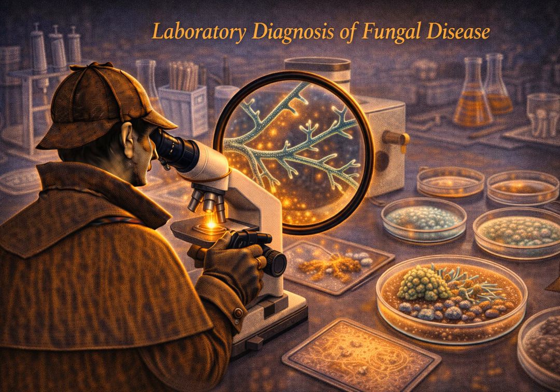All right, we've seen the enemy. Now we need to capture it and interrogate it. Section 3. Culture. The growth engine. Culture is still the absolute gold standard. Despite all our modern molecular advances, honestly, nothing beats growing the live organism. It allows you to test for specific antifungal drug resistance, and it allows for definitive morphological identification.